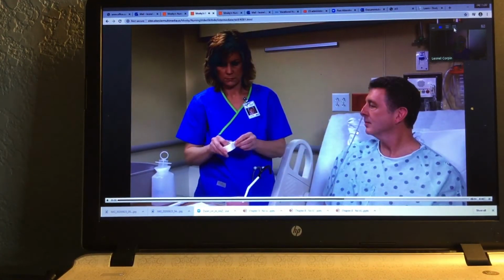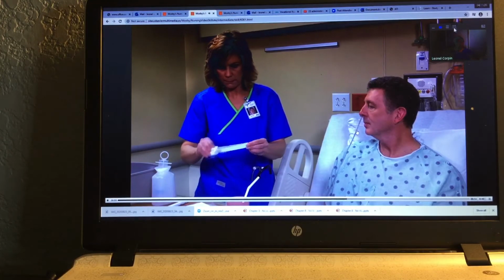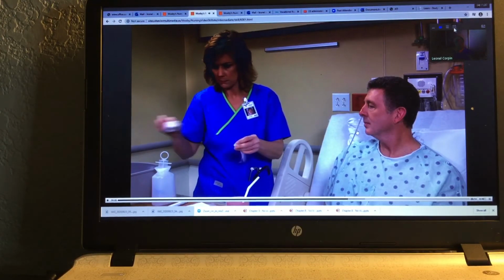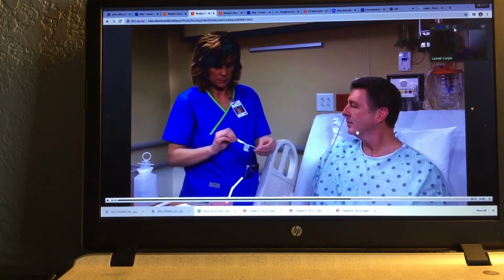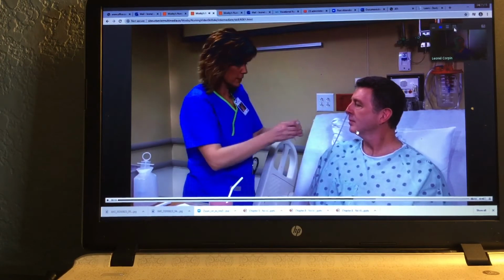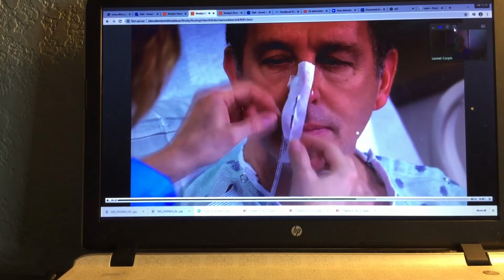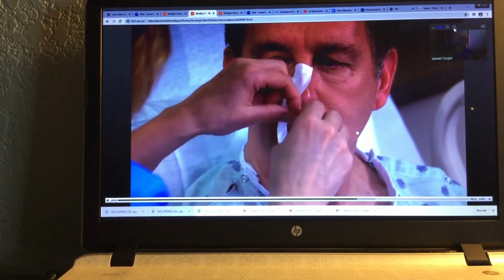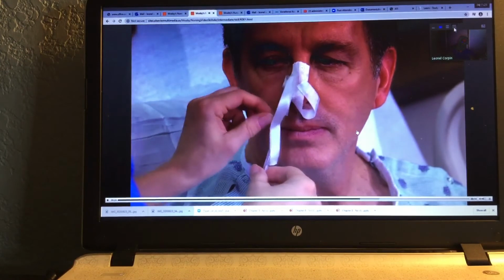Remove your gloves and tear a 10-centimeter piece of hypoallergenic tape. Then at one end, split the tape about 5 centimeters. I'm going to place it on the bridge of your nose now. Place the intact end of the tape over the bridge of the patient's nose. Secure the ends of the new tape out of the way while removing the temporary tape.